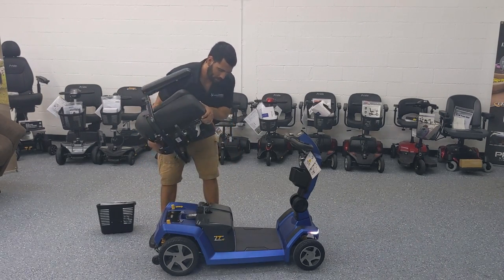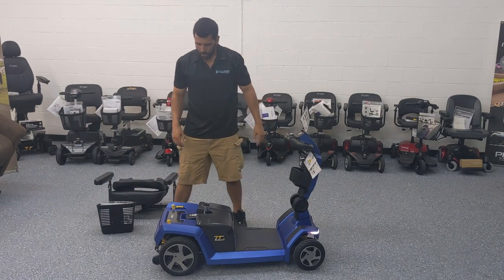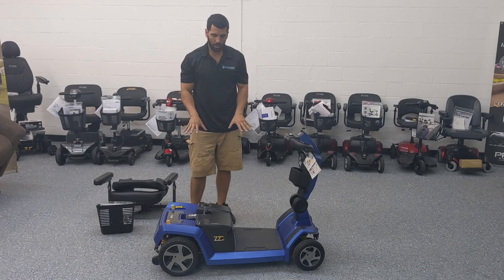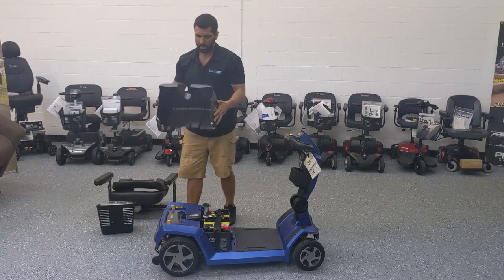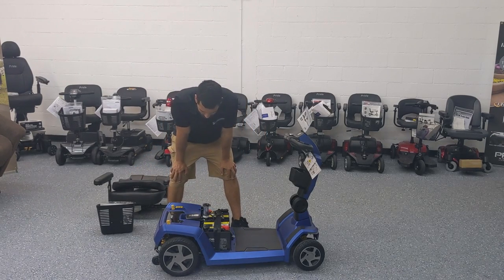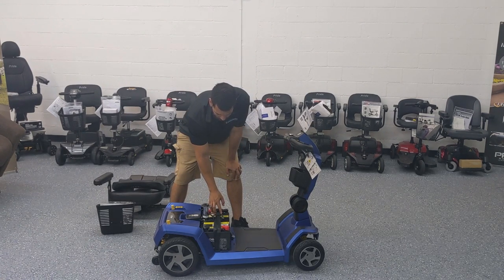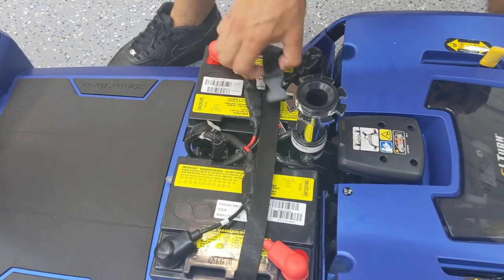We're going to go ahead and disassemble it now. The first step is to raise the seat and take it right out — easy as one, two, three, you just pick it up. The next step is to turn the battery off and uncover the battery area. You simply lift up this plastic shroud cover and it comes right off. There you can see the ZT10 insignia identifying the scooter, which is common across all Pride mobility scooters. The first step then is to find the battery strap buckle — we're going to get the camera up close so you can see.